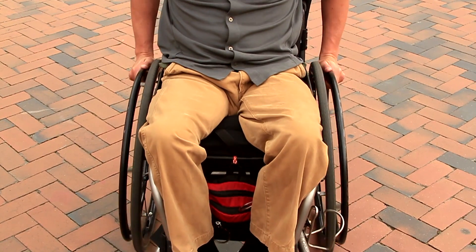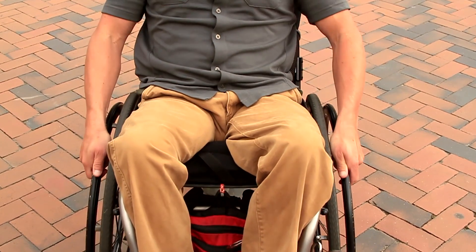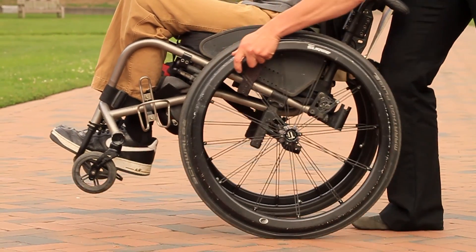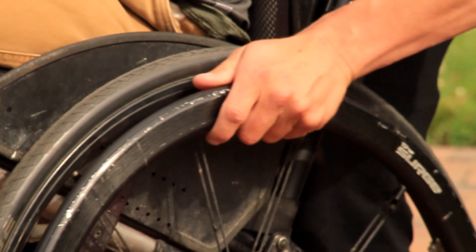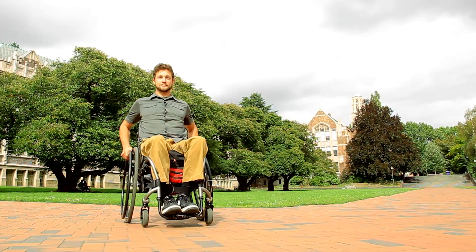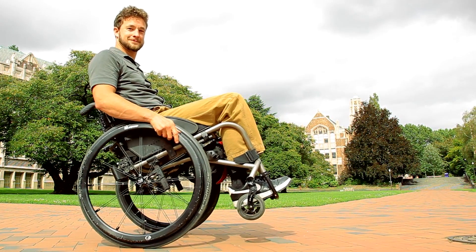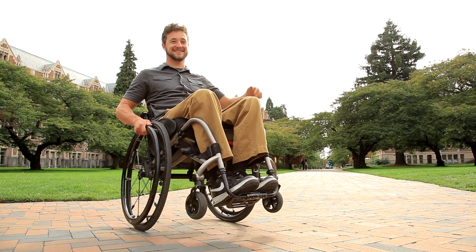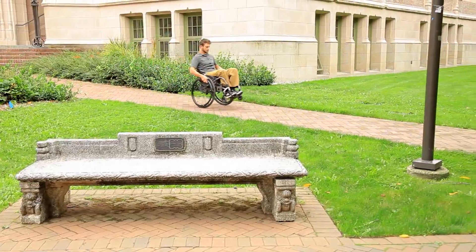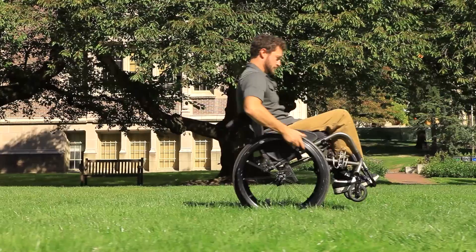Try changing the speed and force of your hand rim pushes. If you struggle with maintaining the wheelie, increase your level of control by ensuring that your hands are near the top of the hand rim while balancing, giving you room to make minor balance corrections in either direction. With an ideal wheelchair setup and practice, you should be able to enter a wheelie with ease. Set a goal of being able to stay in place in a wheelie for several minutes, starting with a few seconds and building up as you master the skill. If you struggle with this technique, a physical or occupational therapist that is a wheelchair seating specialist may be able to adjust your wheelchair or provide you with wheelie lessons.